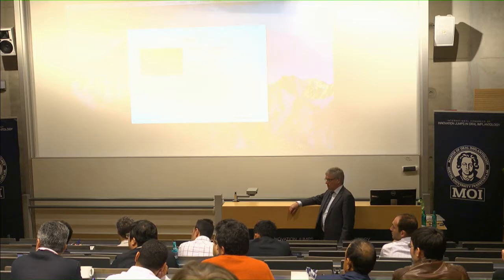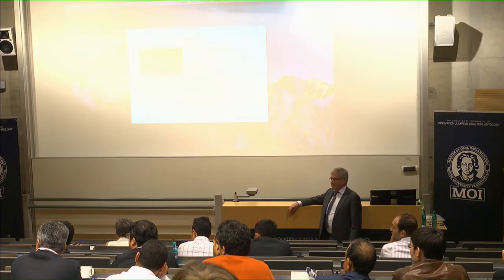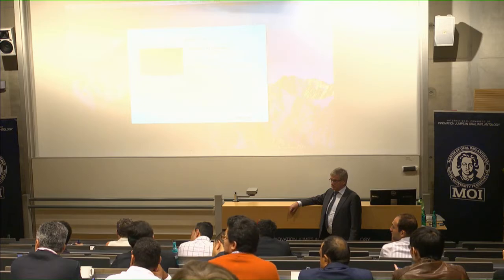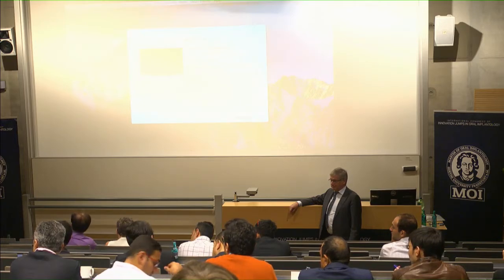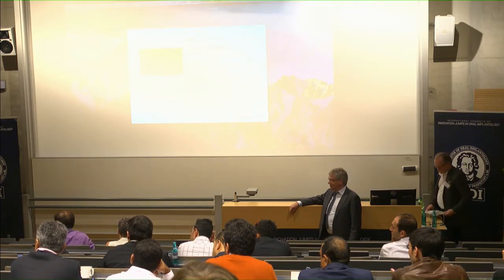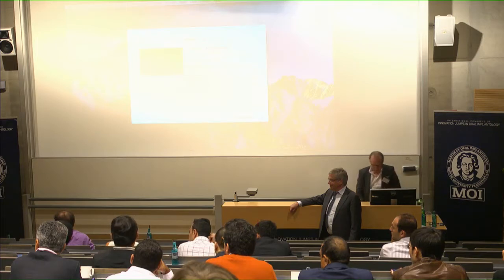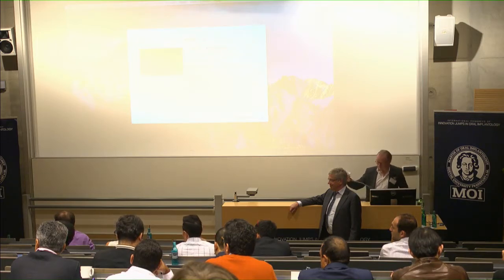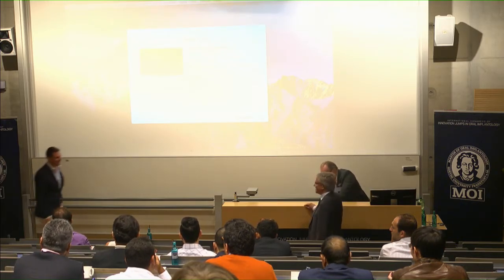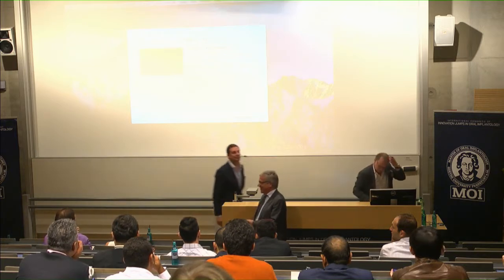Have you used Implant Studio? I use it every day. And do you also pre-order the temporaries? I have the lab software as well, so I use the continuous workflow. I do my implant planning and then extend it into the lab side of the software, and mill provisionals in-house. Yeah, that's what I do as well. But the indexing from Straumann is incorrect. I have done 122 single implants with temporization now, and the indexation is wrong in every single case. Systematic error.